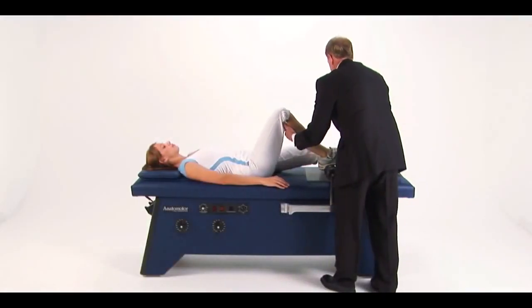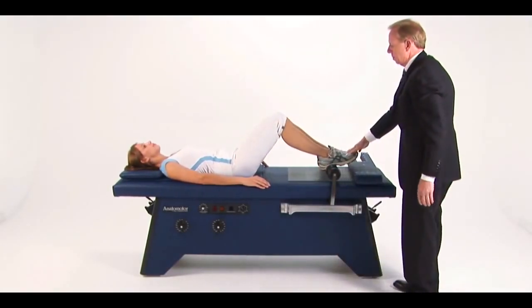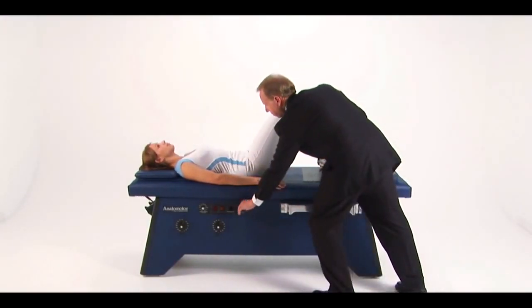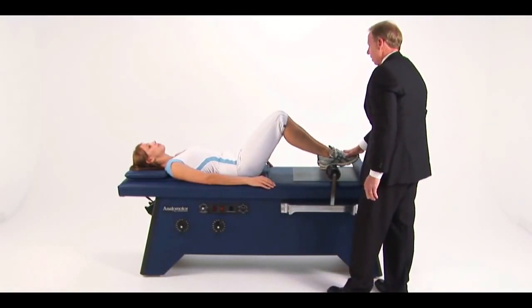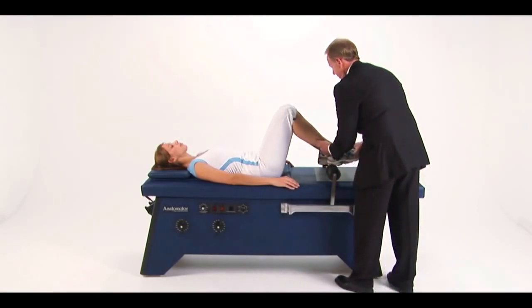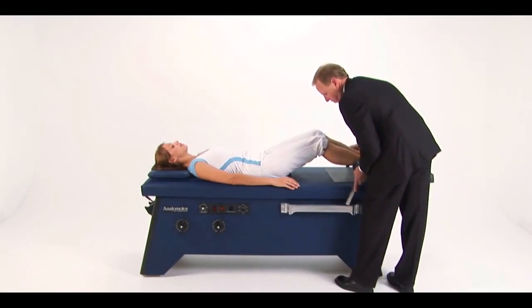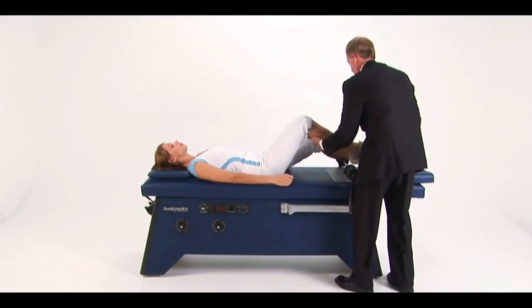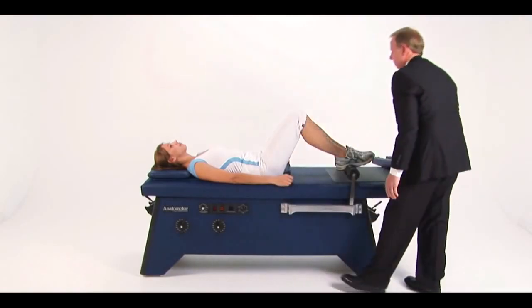The leg roller bar is also useful for passive hip and knee exercise. The slot position in the side rail determines the degree of knee flexion. Generally, it's advisable to start in one of the two slots closest to the foot end of the table. Set the table switch to the lumbar position and determine how much flexion the patient can tolerate. To increase or decrease flexion, move the leg roller bar up or down or adjust the patient's position on the table. If the timer is set at 10 minutes, the patient will receive about 80 knee flexions.